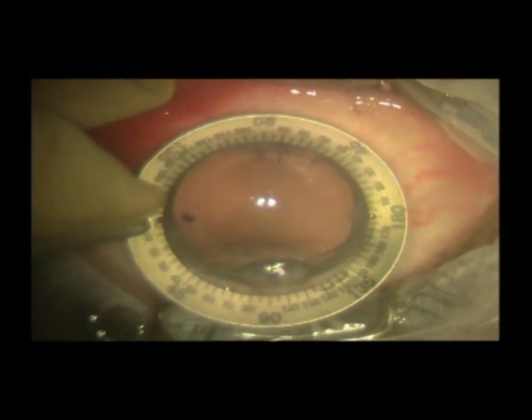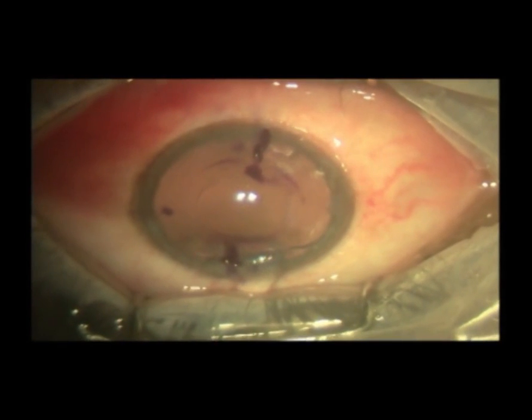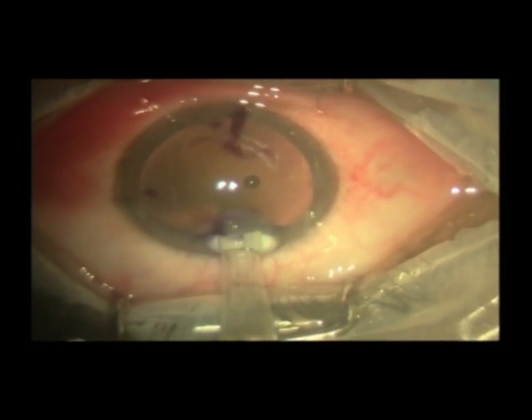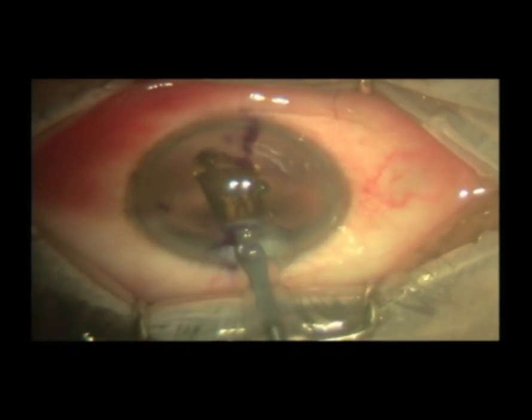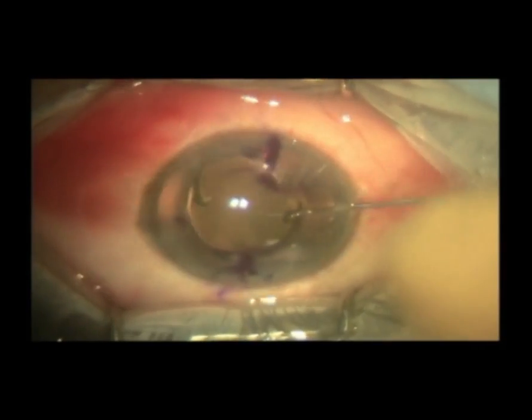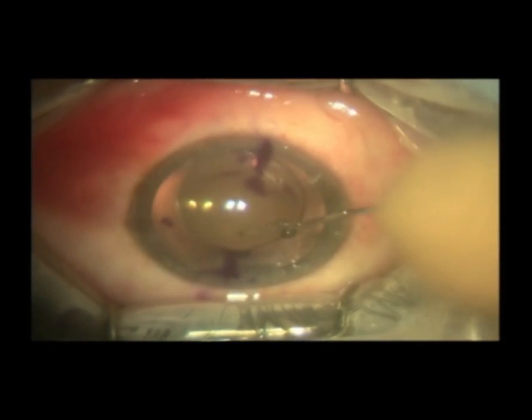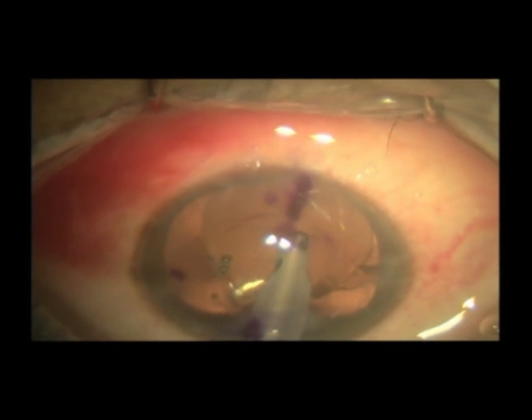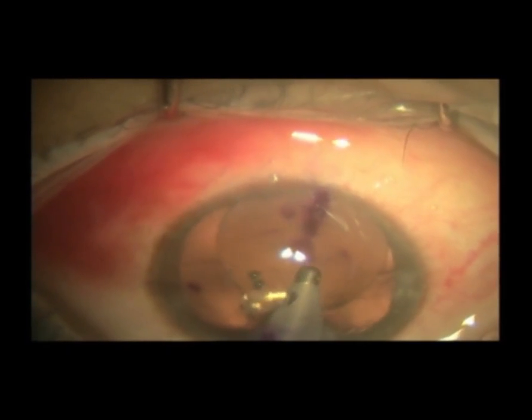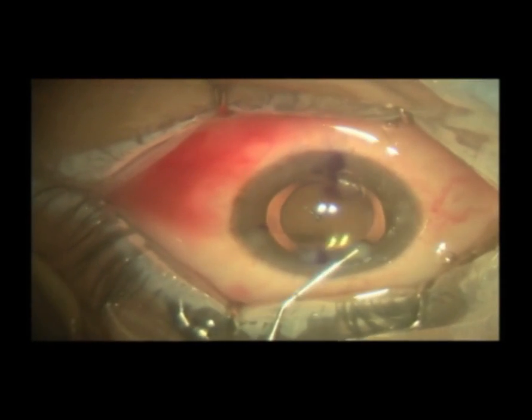Before inserting the foldable hydrophobic toric intraocular lens, the axis of placement is marked. Smudging of the marks occurs if there is even a little fluid on the corneal surface. A little viscoelastic left behind the lens can cause rotation of the lens in the early postoperative period. Hence, a complete viscoelastic wash is recommended.